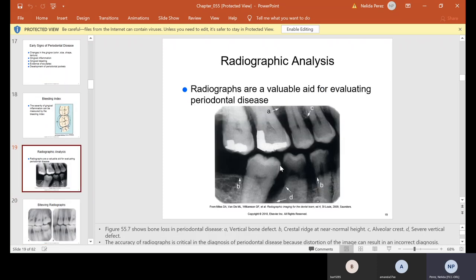When you take x-rays and look at them, they will show bone loss. Letter A is showing vertical bone loss — the coronal portion of the teeth is where the gum should be. At A the bone is way up; at B the crestal ridge is at pretty normal height. Going back to C, this is the alveolar crest already dropping, and D — this is super severe periodontal disease.